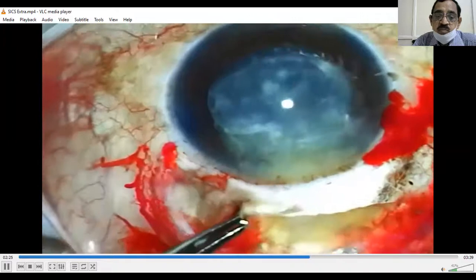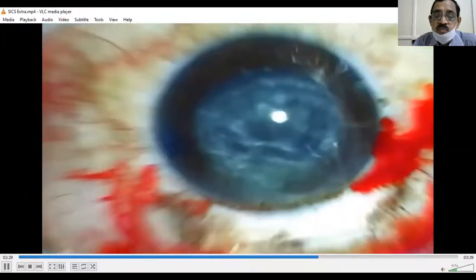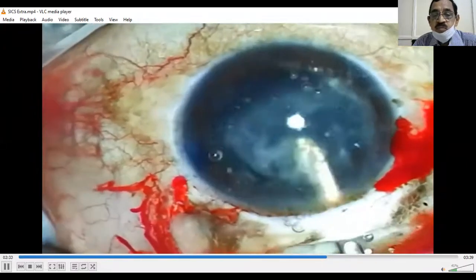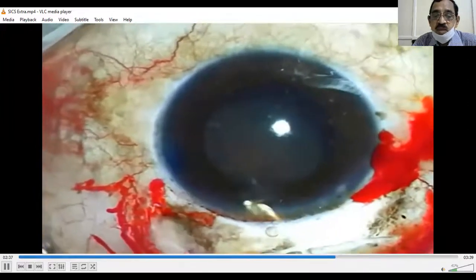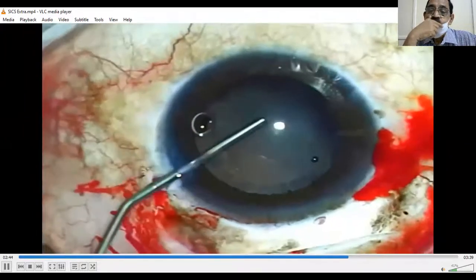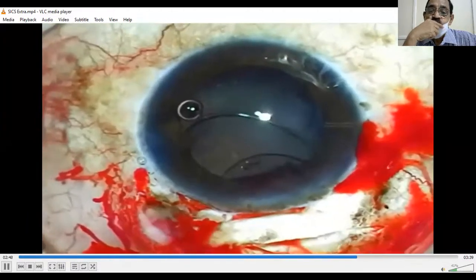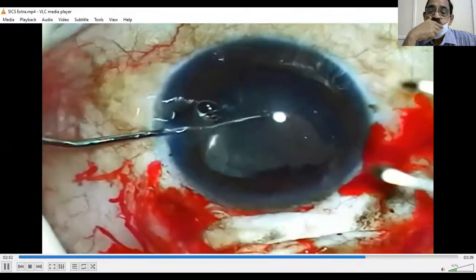The lens loop is used to remove the lens from the eye. And then the Simcoe cannula is used to remove the remaining cortical material. Some of these cases can be very quick and easy when there is not much cortex left. Viscoelastic is used to fill the capsular bag. And then a one-piece PMMA lens is placed into the eye using forceps. And then using a Sinskey hook, it is grasped by this eyelet and then rotated into the capsular bag.